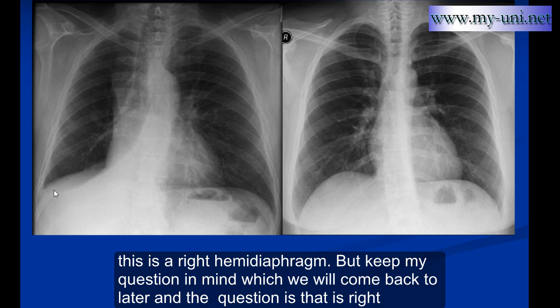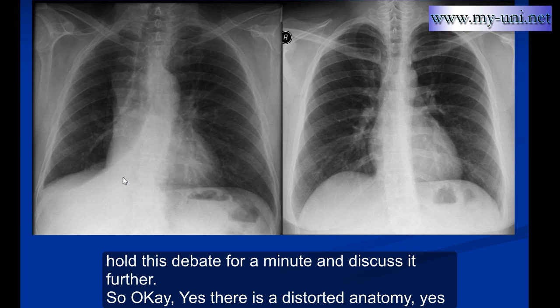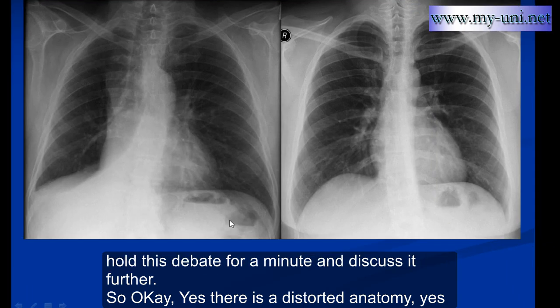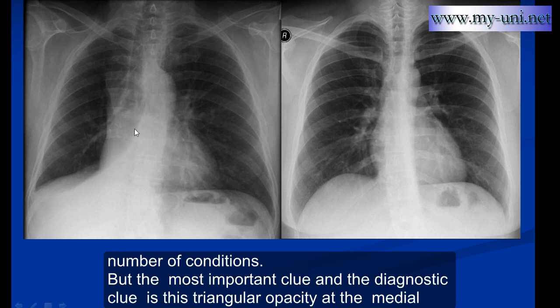Keep this question in mind — we will come back to it later. The question is whether the right hemidiaphragm is really visible. Most people would say yes, this is the right hemidiaphragm, and it looks raised but it is there. Let's hold that debate for a minute. There is distorted anatomy, loss of right lung volume, and the diaphragm is raised, but most features are inconclusive as they can be present in a number of conditions. The most important and diagnostic clue is this triangular opacity at the medial basal part of the right lung.